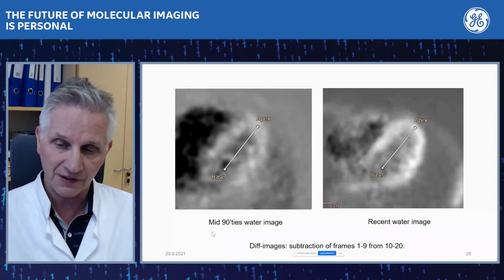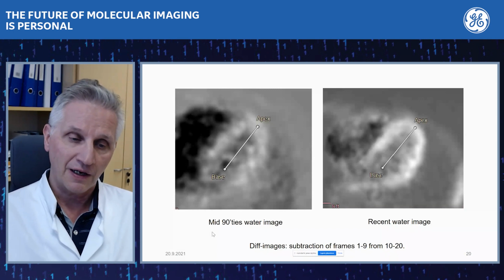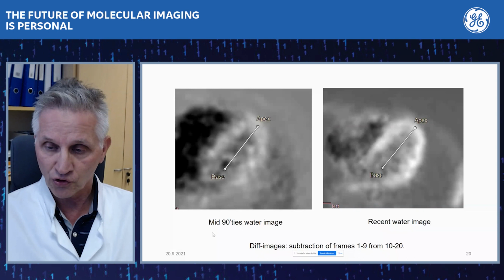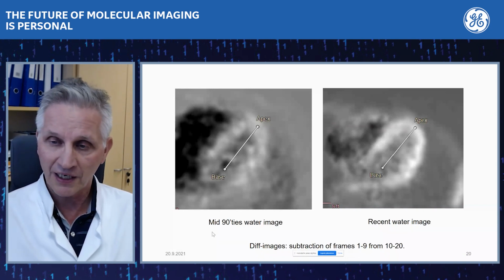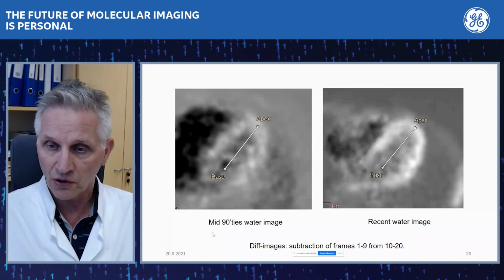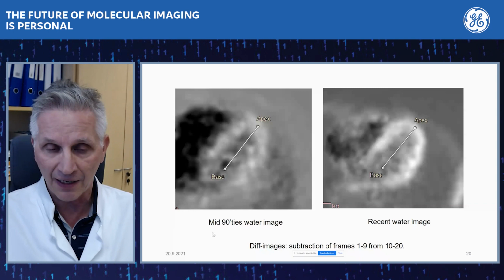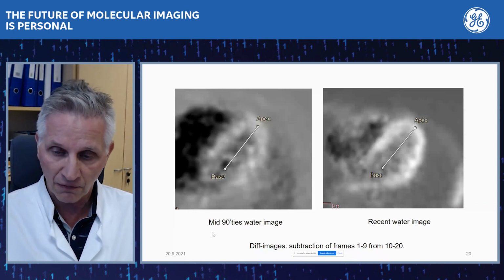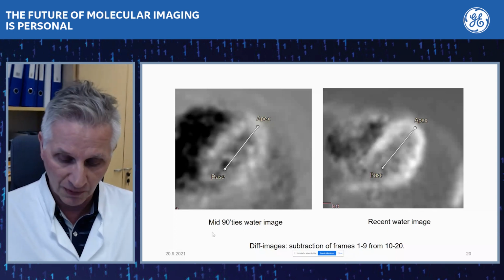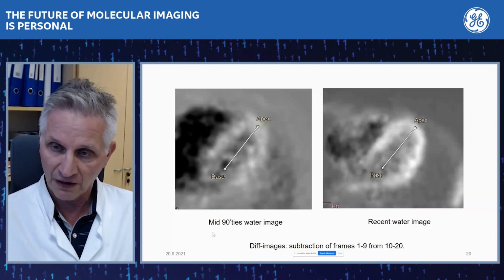And the big difference now, as compared to the old generation of PET scanners versus the most recent PET scanners, is that the image quality for the segmentation has been significantly improved. So that makes the analysis of the water PET images very rapid and very robust, because the image quality is so much improved. And I believe that will also improve our accuracy.